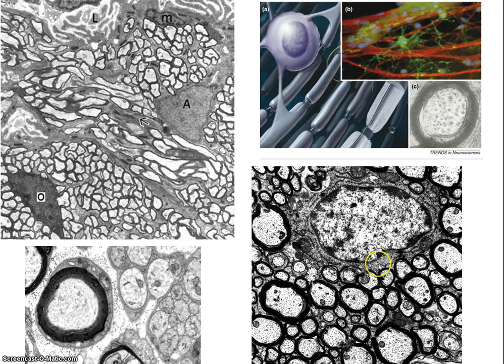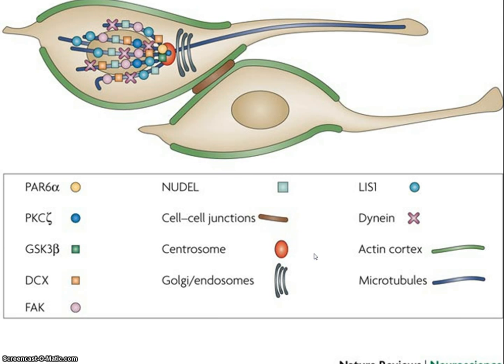How is it moving through the white matter to, well, I'll call it metastasize, but anyway, it's staying within the same tissue, but it's just moving to a new location. So what are the barriers? What does it have to overcome to move through this part of the nervous system? That looks a little bit like connective tissue there, but again, this is the optic nerve, still it's CNS.